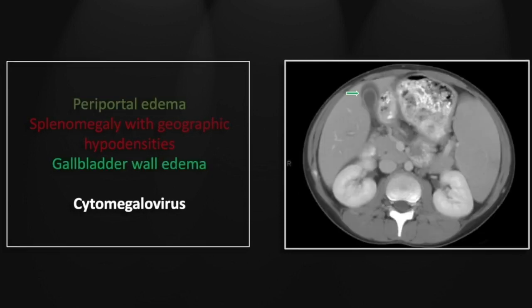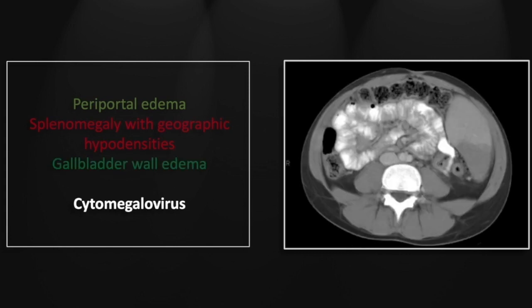Lower down, you can appreciate the marked gallbladder wall edema. Of course, the list of differential possibilities associated with that finding is vast, but cytomegalovirus or other viral hepatitis infections are certainly on that list. And lower down, another one of those geographic hypodensities denoting a splenic infarct.